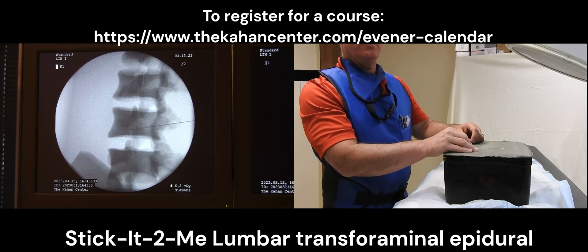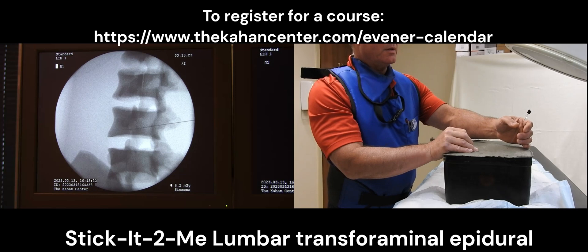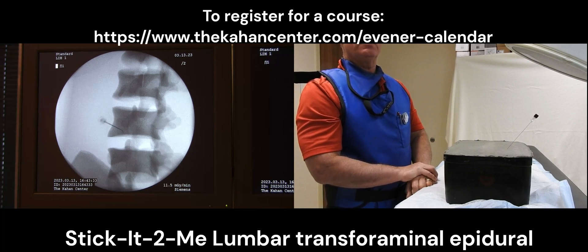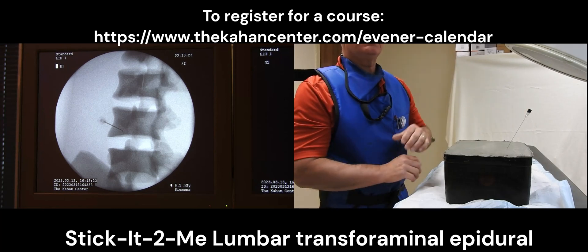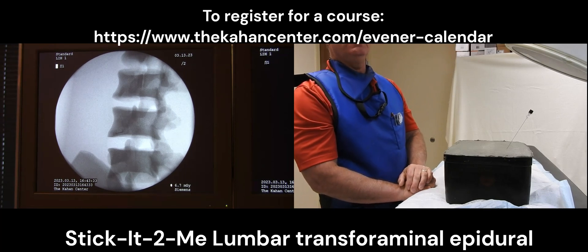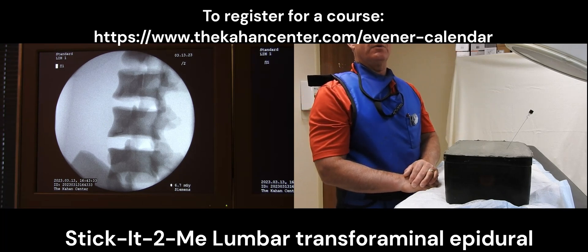Now that I have things marked, I will then move my needle so that I can enter into the skin. I will get the needle so that it will stay upright in the skin and then take my picture as if I'm working on a live patient. I will make sure that my hub is over my needle tip before I advance it. This reduces the amount of fluoro time it takes to advance the needle deep into the transforaminal epidural space. As you can see, the hub is closer to the needle tip and I will gradually advance the needle into the transforaminal epidural space.